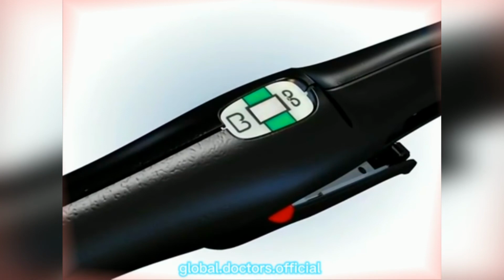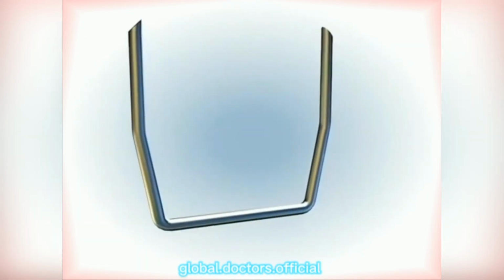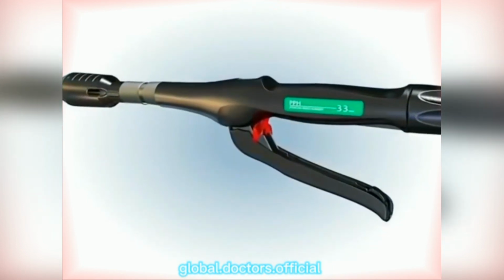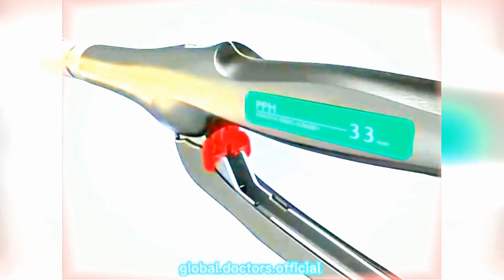the green gap setting scale toward the smaller B, shaped for the shortest closed staple height. Tighter staple compression may reduce risk of bleeding from the staple line. Be certain not to touch the safety until the device is ready to fire. Release the safety and fire in one fluid motion.